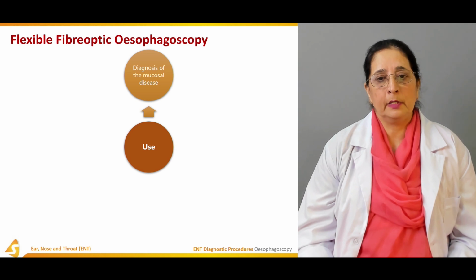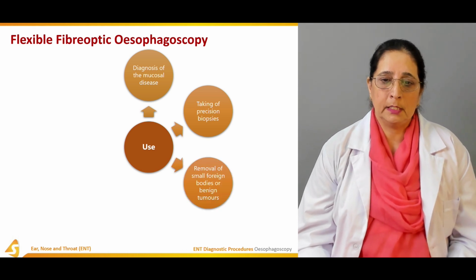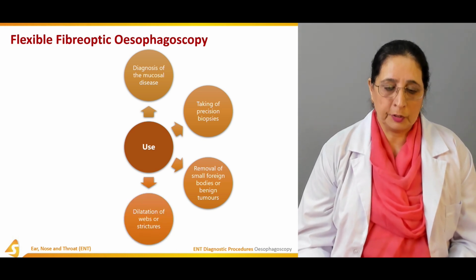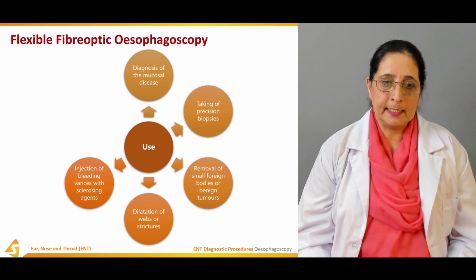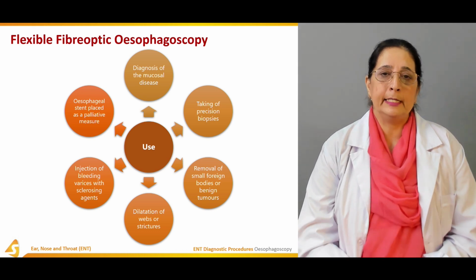Use is for the diagnosis of mucosal disease, taking of biopsies, removal of foreign bodies or tumors, dilatation of webs or strictures, injection of varices with sclerosing agents, and esophageal stent placement as a palliative measure.